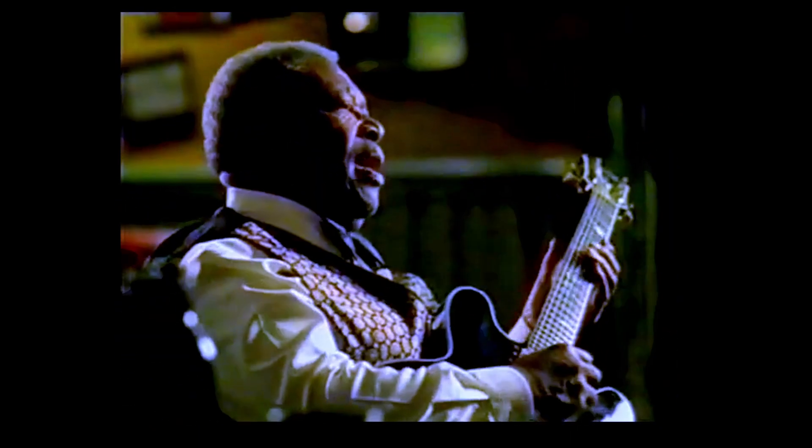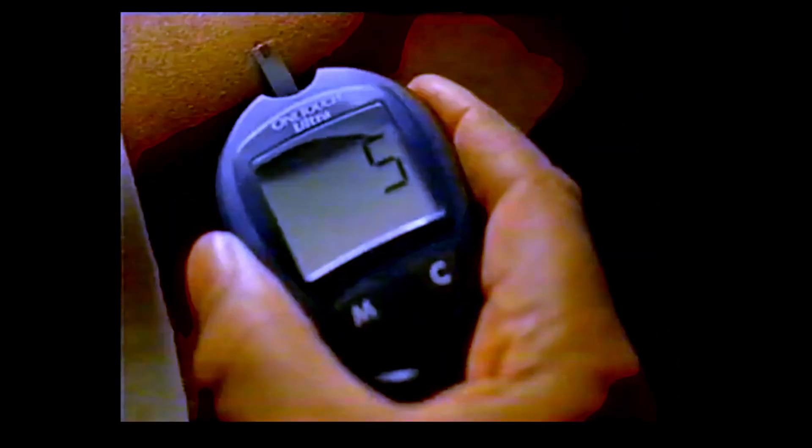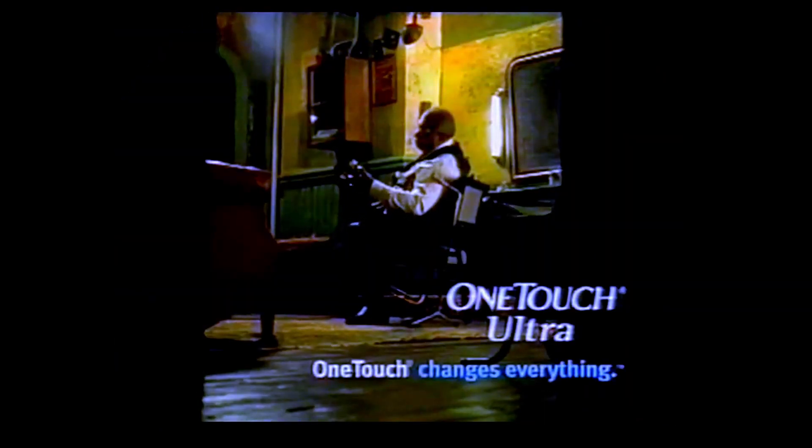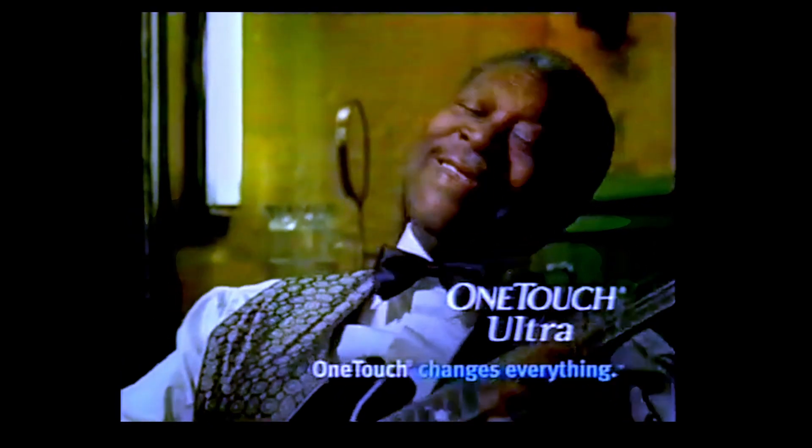I'm leaving the pain behind me. New OneTouch Ultra requires less blood, so you can test on your arm where it's less painful. Introducing the OneTouch Ultra. I've been waiting for this for ten years.